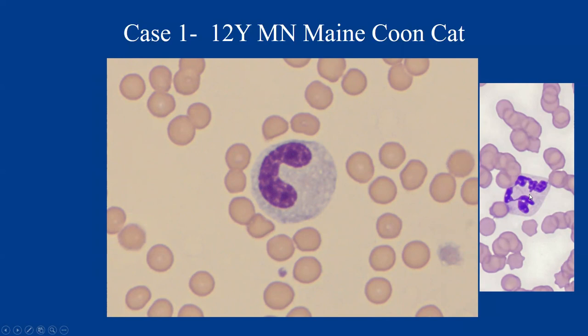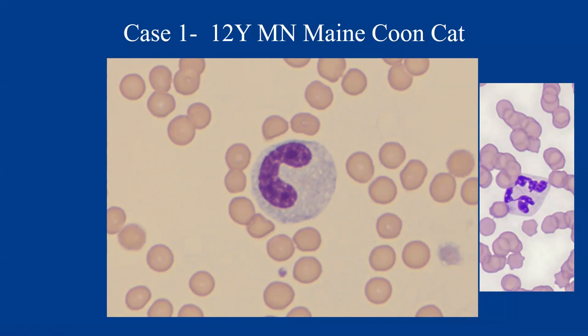Here is another white blood cell that looks different than the last one. It has cytoplasmic basophilia indicating toxicity, and also foaminess to the cytoplasm — another indicator of toxic change. The nucleus is pretty U-shaped or band-shaped. So this is a band cell. Band cells are a step before your segmented neutrophil in production. When we start to release bands into circulation, that is called a left shift. It means the bone marrow is trying to keep up with an inflammatory stimulus, and our normal mature neutrophils are being consumed, so the bone marrow releases immature precursors. Left shifts are usually associated with inflammatory conditions.